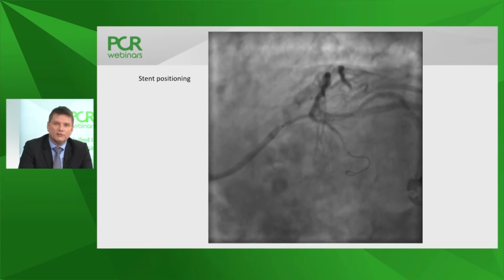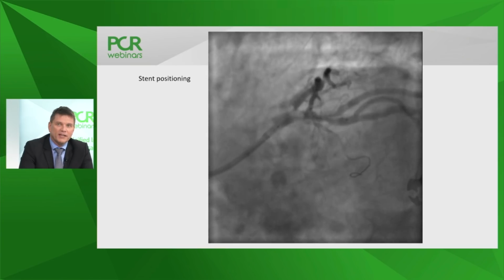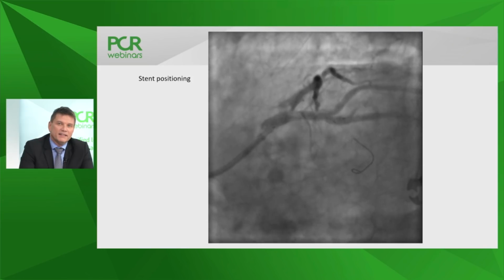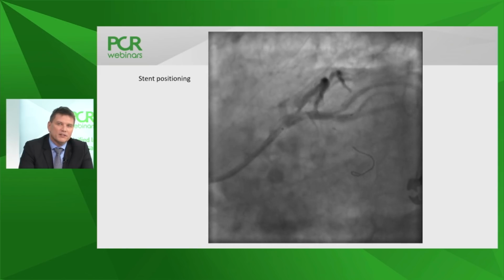Well, number one, it makes a lot of sense to try to stent over the ostium of the marginal, because I think you want to treat this bifurcation anyway. And then the question is adding an additional wire. This would be the third wire. You can do it, and you can always add complexity to the lesion. Honestly, I think there will be maybe some pinching of the vessel, but I might have done the same.